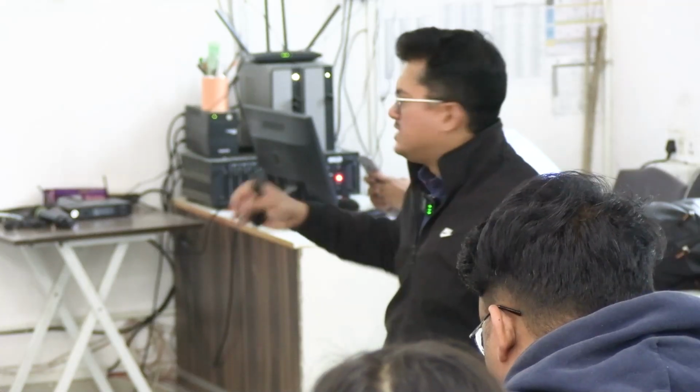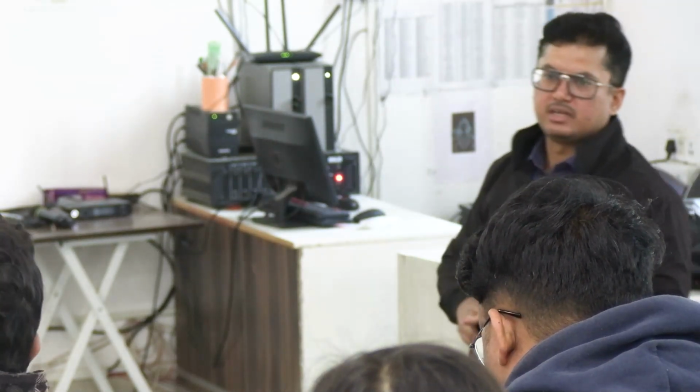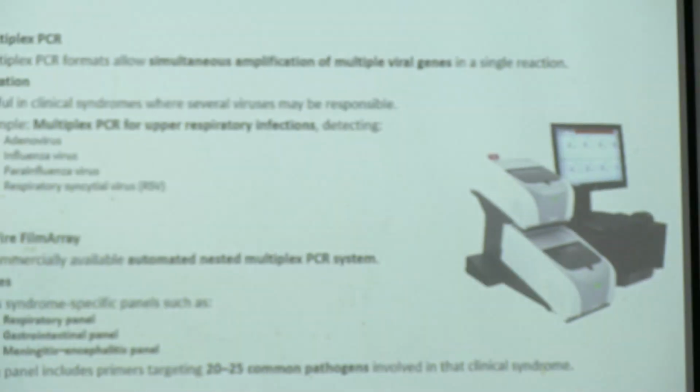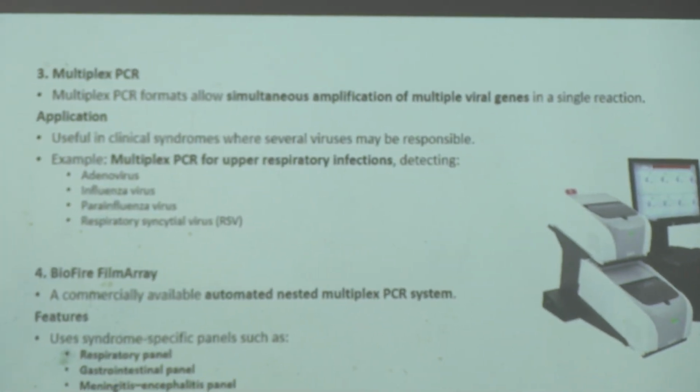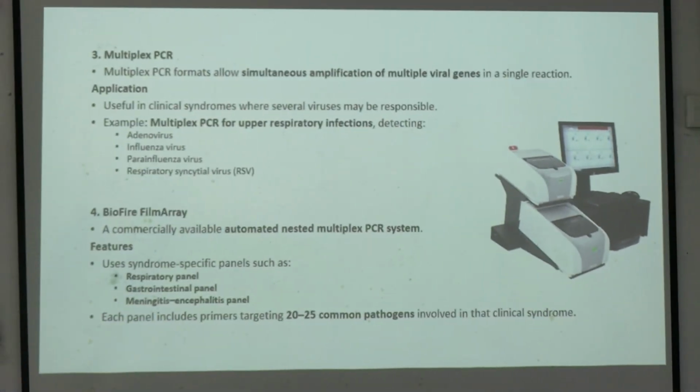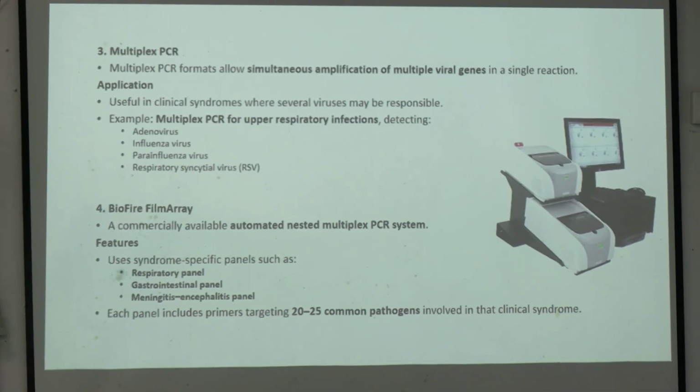Okay, PCR এর প্রচুর টাইপ আছে, রিয়েল টাইম PCR আছে, জেলডক PCR রয়েছে, will not go into the details, this is not a PCR class. ওকে, মাল্টিপ্লেক্স PCR মানে কি হচ্ছে, যে এখানে তুমি একটা ভাইরাস ডিটেক্ট করছো না, মাল্টিপল ভাইরাসেস ডিটেক্ট করো। Suppose you are trying to find hepatitis B, HCV and HIV in a single sample.